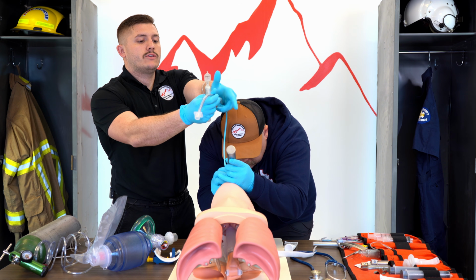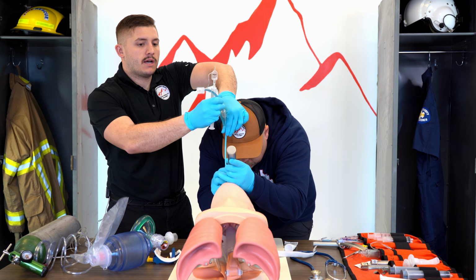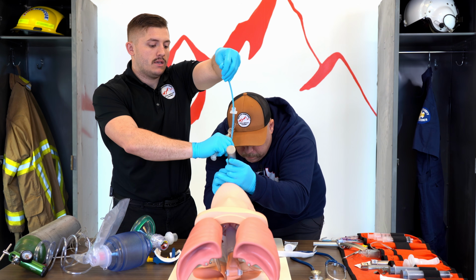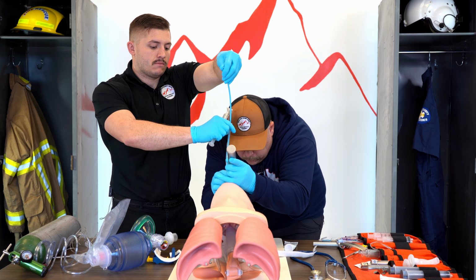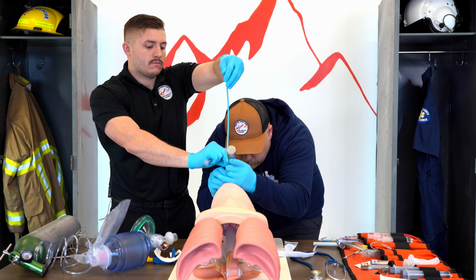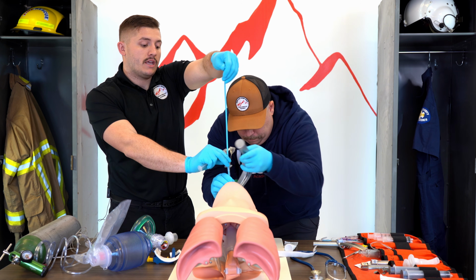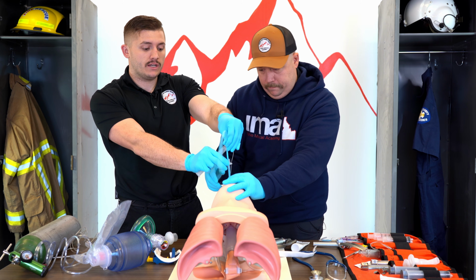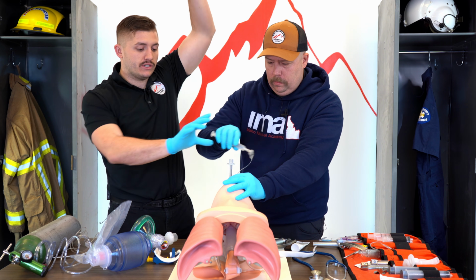Okay, I'm going to place that tube on. Tube coming. I'm basically just bringing it to him. "All right, you hold him from the top?" "Yep." "All right, we're good?" And then he'll probably have me pull this bougie, but I'm not going to do it until he tells me to do it. We do not want to lose this airway.